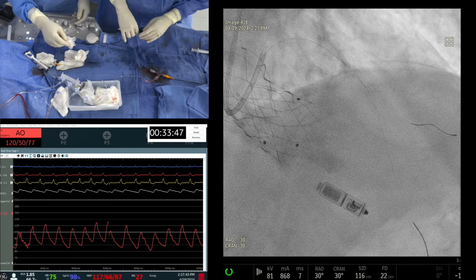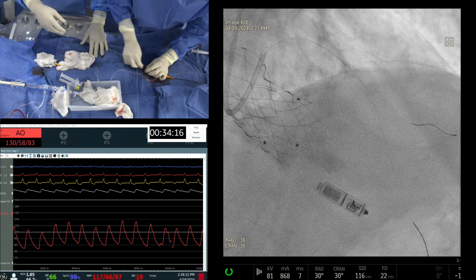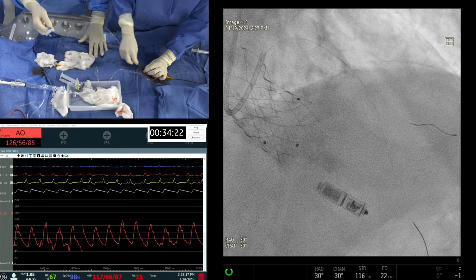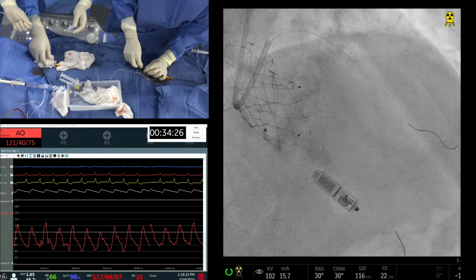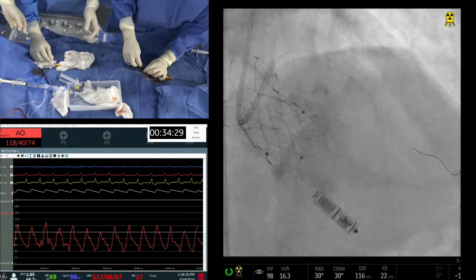And that's FC, because the radiopaque portion is not that long. The XTs have the longer radiopaque portion. So this is Fielder FC, and then you have a Runthrough in your main vessel. I think that's great, and you don't confuse the colors and stuff. Let's go. This is the 2.0 by 12 compliant balloon, going into the diagonal. This is the test. Oh, good.